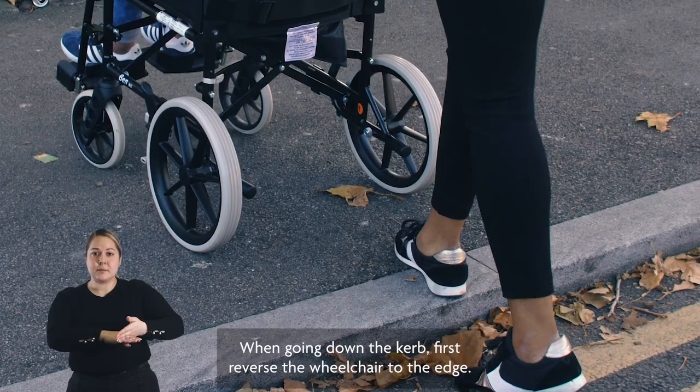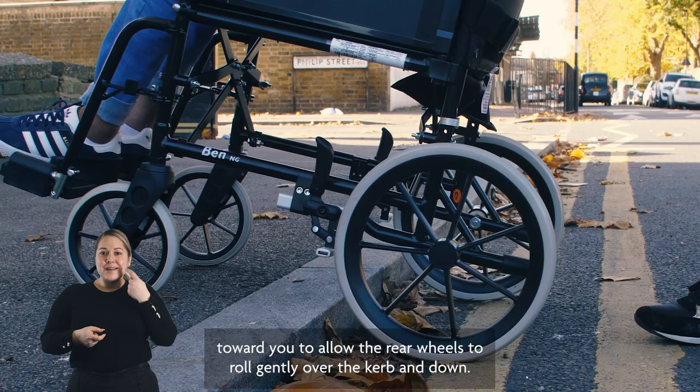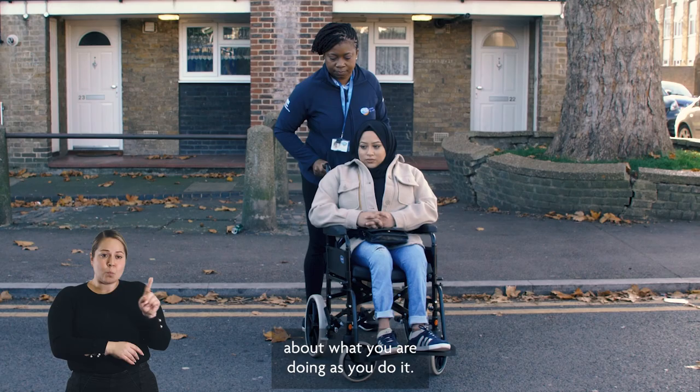The rear wheels will ride up onto the pavement. Make sure that all four wheels are in contact with the ground before moving the wheelchair away. When going down a curb, first reverse the wheelchair to the edge, then pull the wheelchair toward you to allow the rear wheels to roll gently over the curb and down, then lower the front wheels onto the flat surface before moving the wheelchair away.